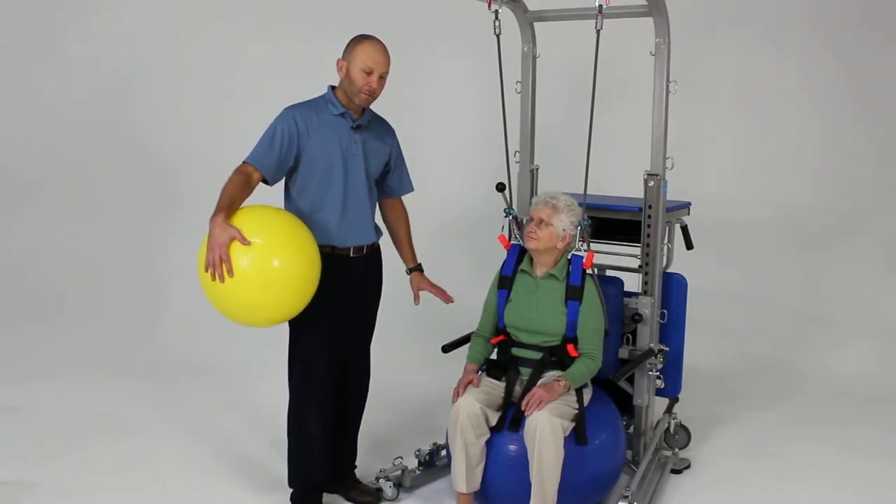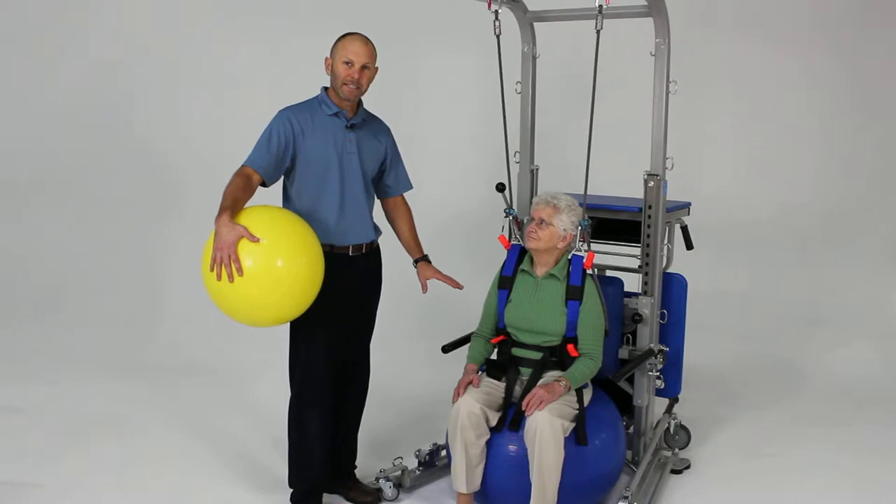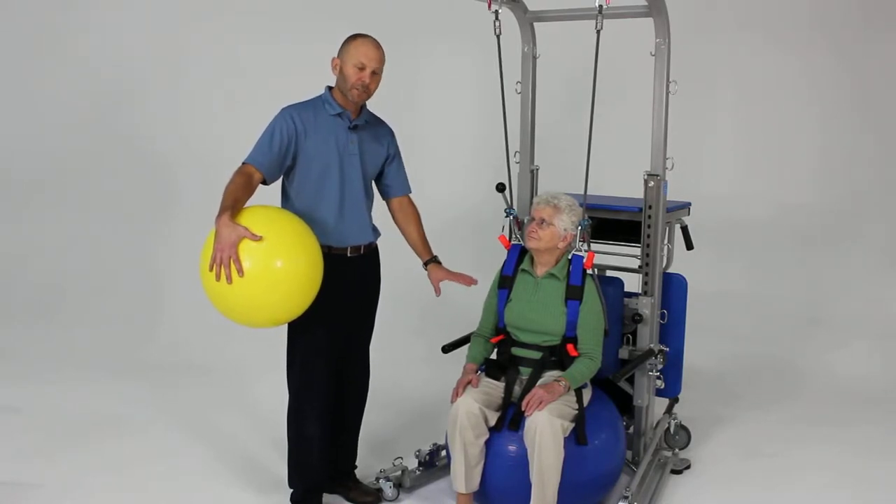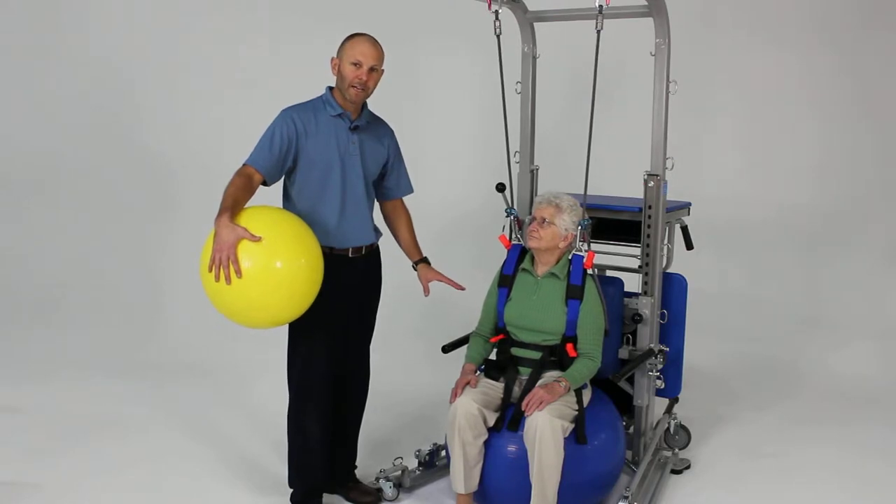We last showed you some of the more basic balance activities in seated, which was on that stable bench. The rehab station works excellent also for doing more aggressive balance activities and progression.